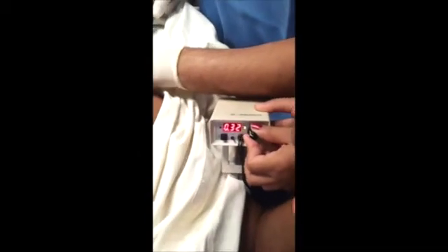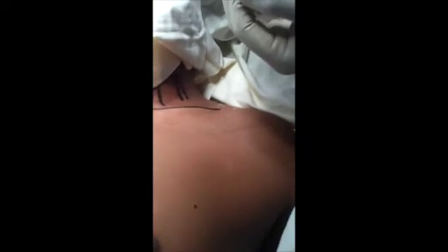We are getting contraction, which means we are in the correct position and not too internal. We will aspirate and go for injection — it is going freely. The local anesthetic is injecting very nicely. See the free flow of local anesthetic. The needle is in the proper plane, so the block will definitely work.